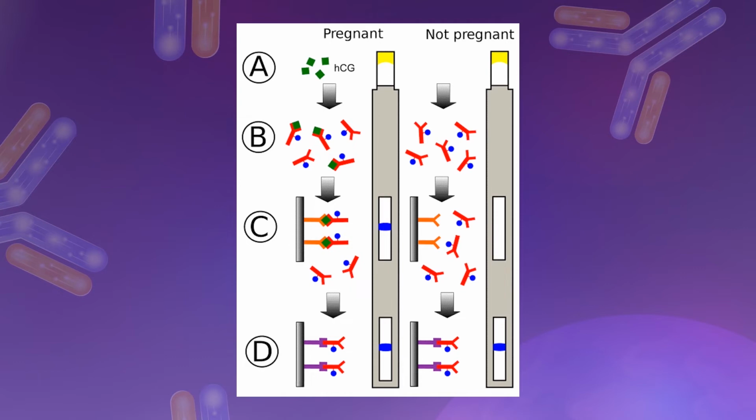Then after this, we can see the two strips for a positive pregnant woman.